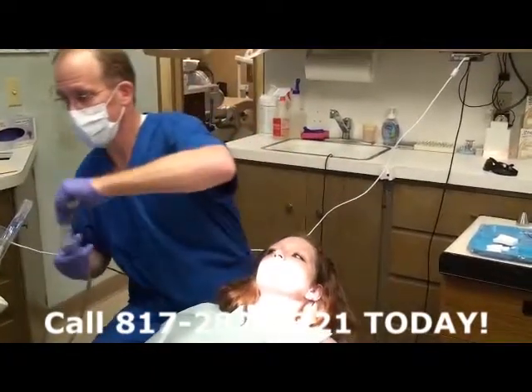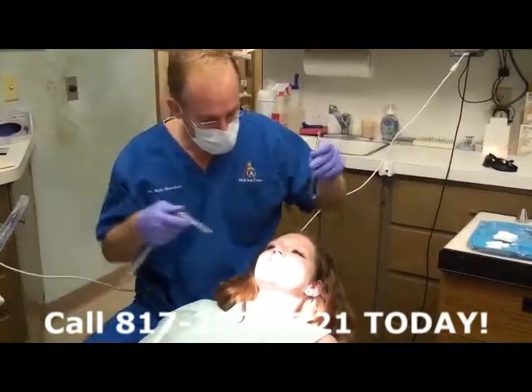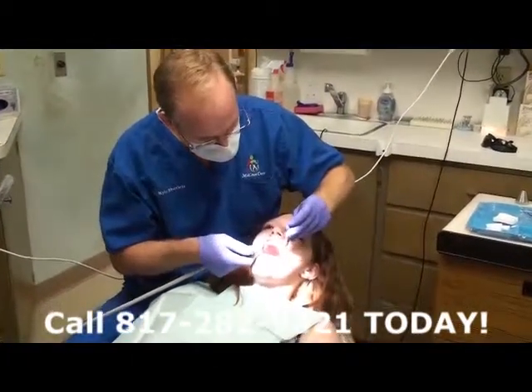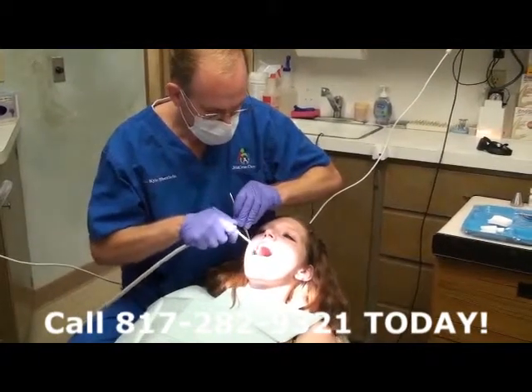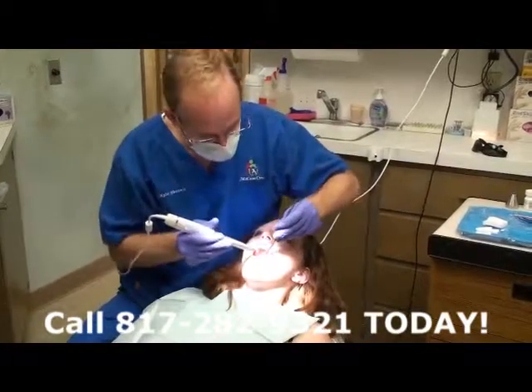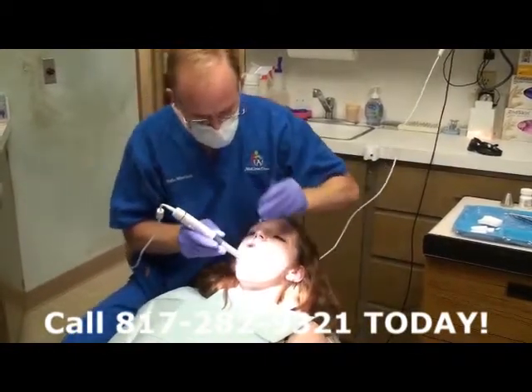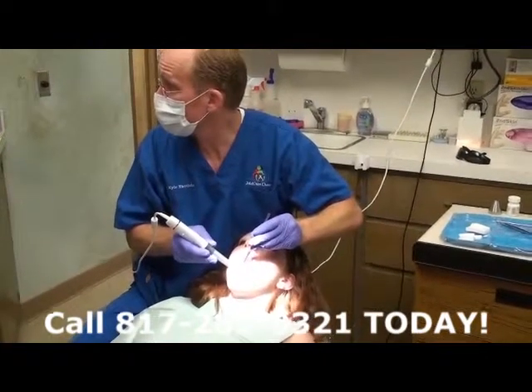you can determine if there's any constriction of the palate, or if there's any indication that the patient may need orthodontics and things like that. In her particular case, it looks like she has nice teeth. She's got a pretty smile. And I'm just going to take a few pictures here so that we can see if there's anything going on.